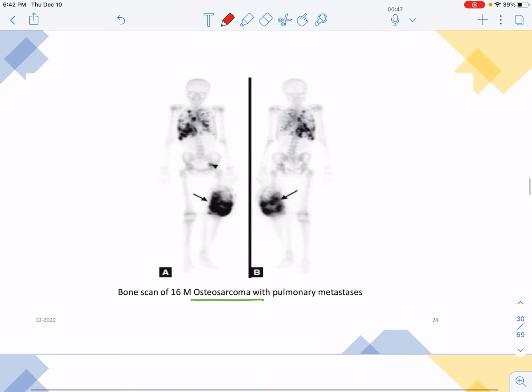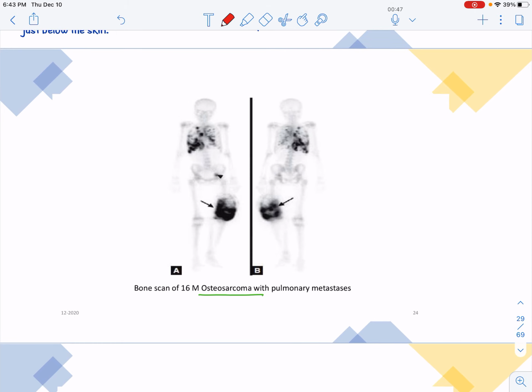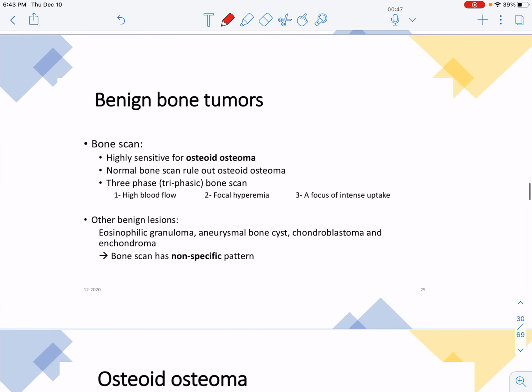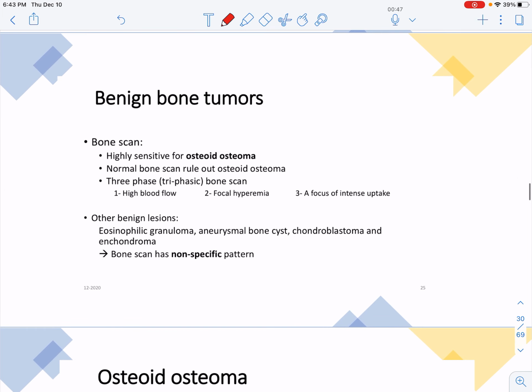هذه osteosarcoma زي ما قلنا انه شكلها مو حلو عندنا في bone scan، والأفضل مننا في هذا البارت MRI. عندنا benign tumor، احنا مرة كويسين في detecting osteoid osteoma. and أول ما تشوفوا ده حتى ال whole body scan we can see it sometime the osteoid osteoma.